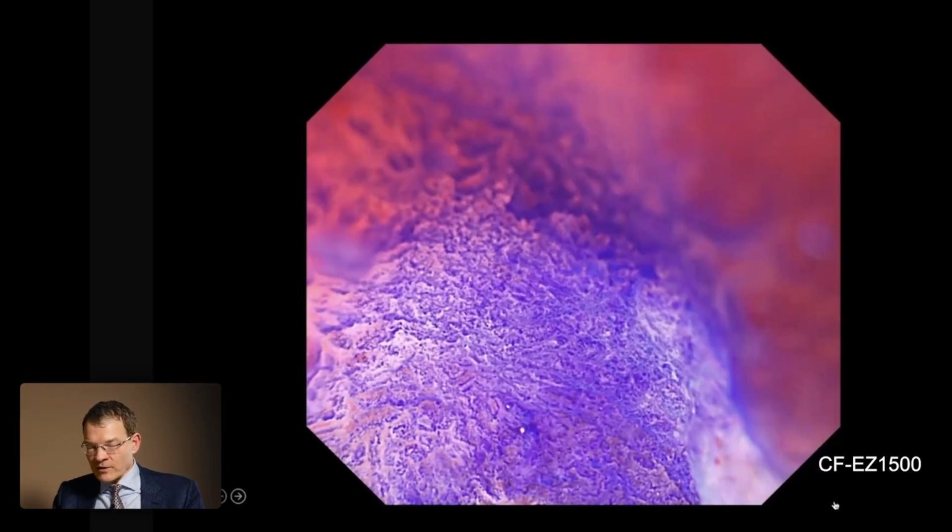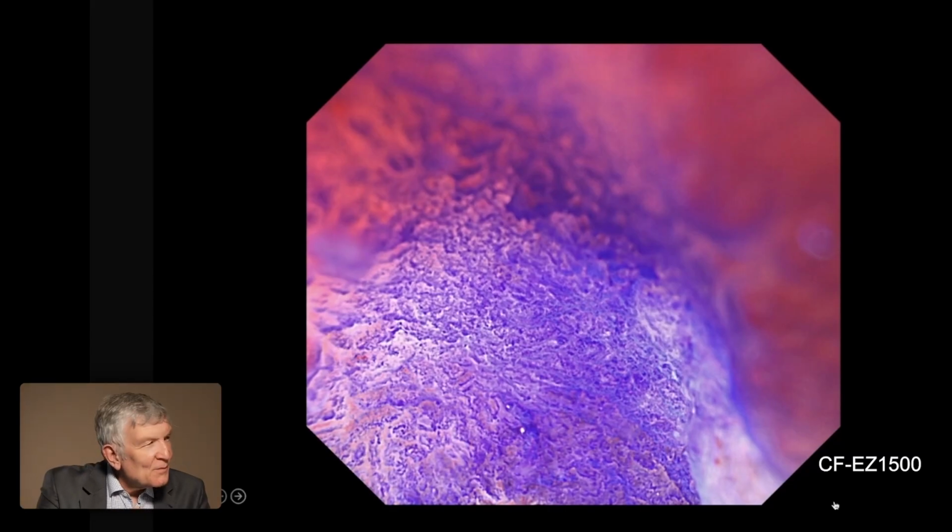So this is our regular approach in such borderline lesions where we have a huge discussion what to do. First we use all the new features, we do underwater endoscopy, and we also do this crystal violet staining. Again, same issue. Therapeutic concepts are maybe changing here as well, but very, very nice pictures.